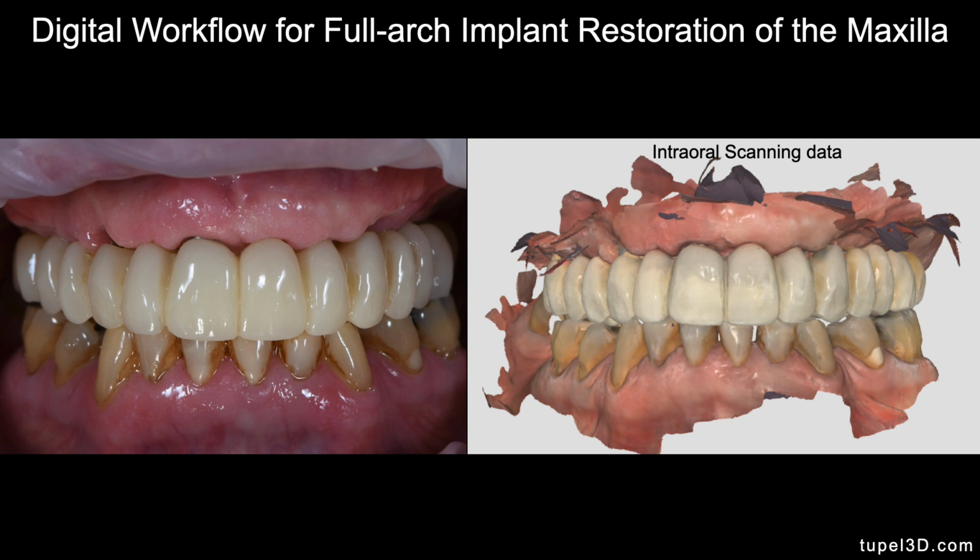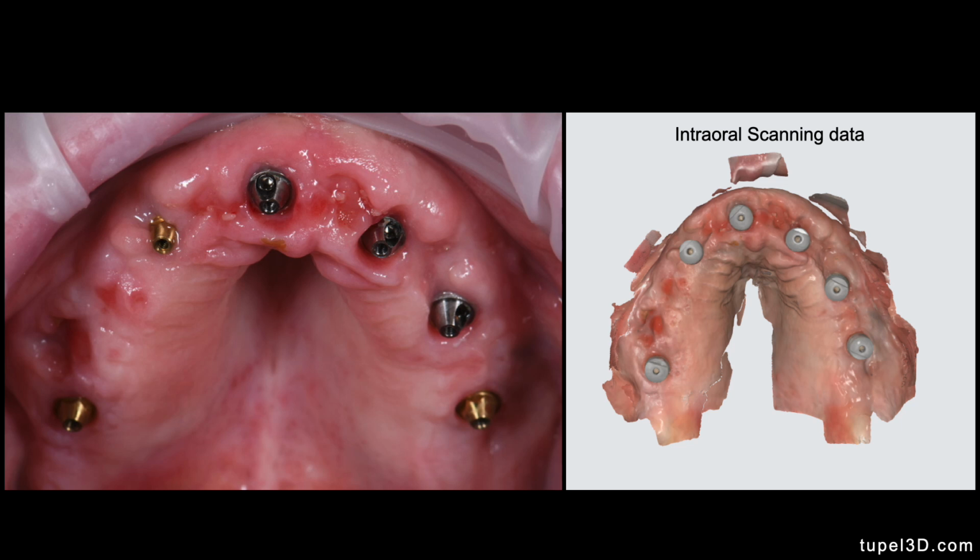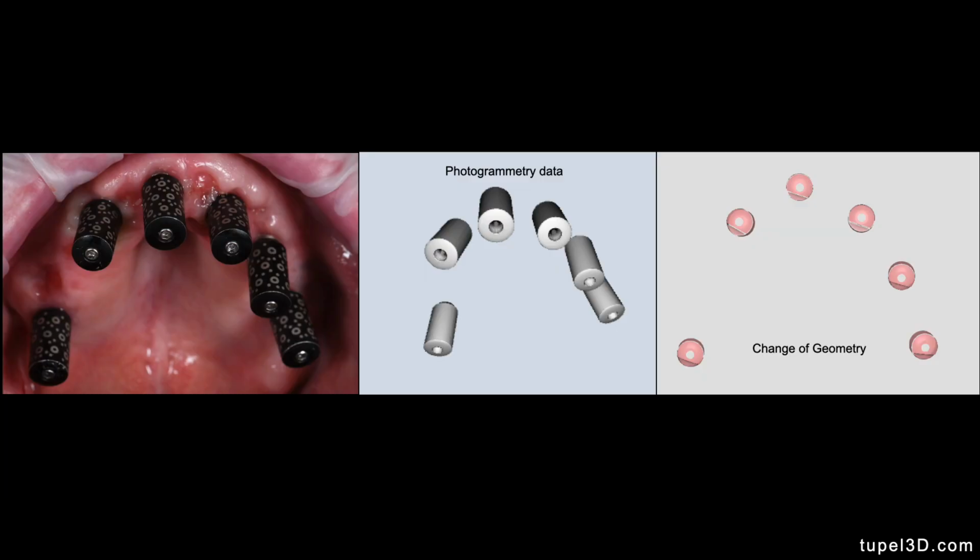So this is a case of a fully digital FP1 complete full arch rehabilitation with the initial 3D printed interim prosthesis, which is going to be scanned. Next we remove the interim prosthesis, we fit the scan bodies, and then we scan the implants and the soft tissue. Next we position the scan dots onto the multi-abutments and perform a scan with the photogrammetry, and then you can change the geometry to your desired scan body.